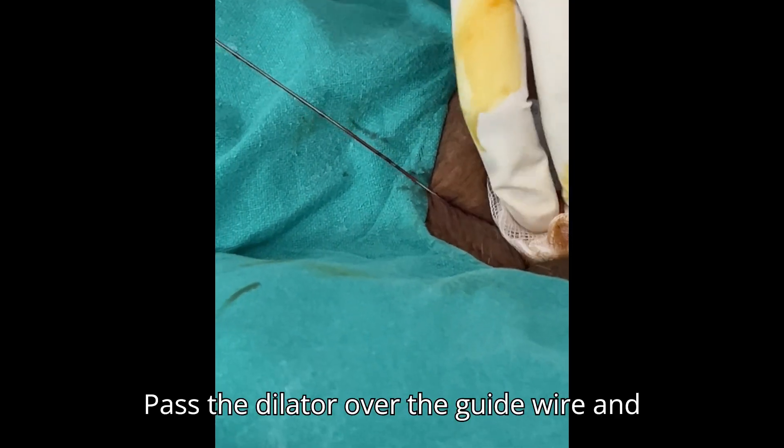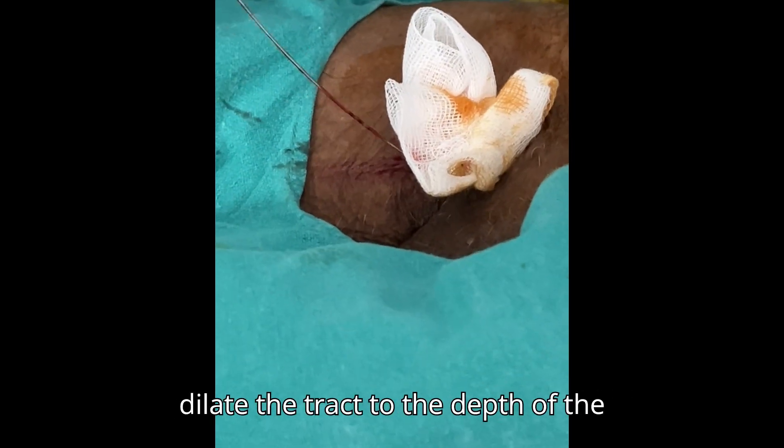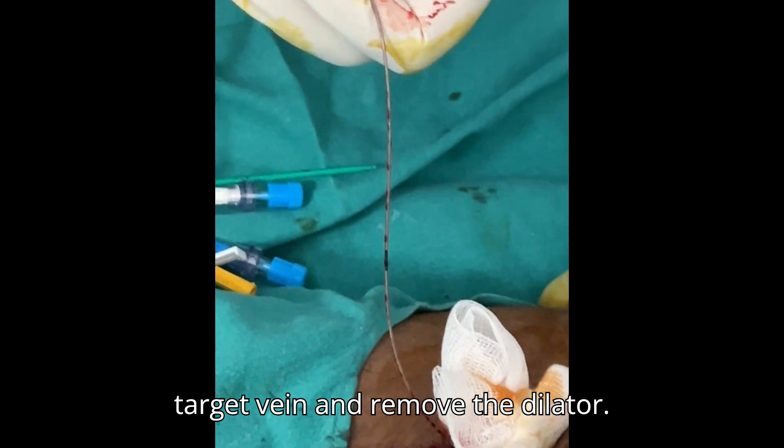Pass the dilator over the guide wire and dilate the tract to the depth of the target vein, then remove the dilator.